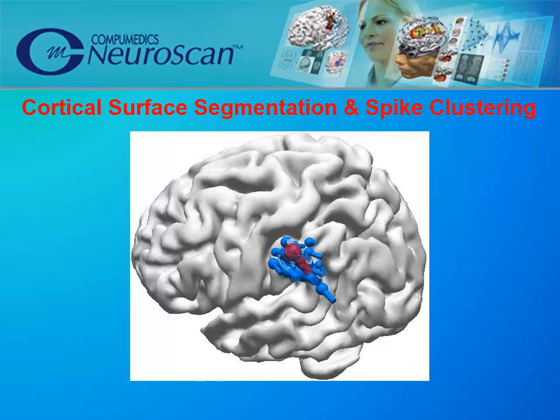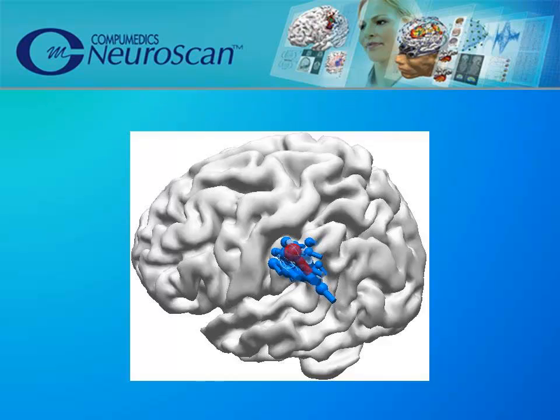The red dipole is the solution for the average of all the spikes, while the blue dipoles represent the location for individual spikes. Confidence ellipsoids depict the one standard deviation confidence volume for location, and can be calculated for individual or average spikes, allowing the clinician to determine the validity of the result.